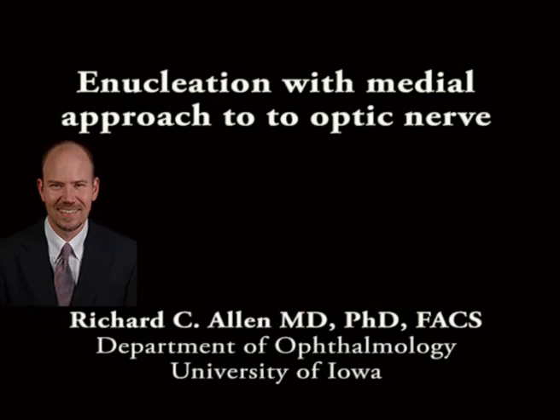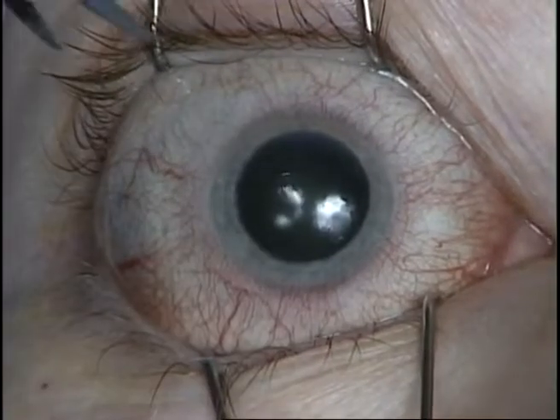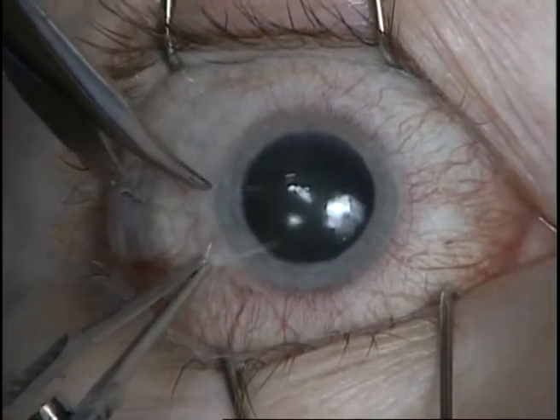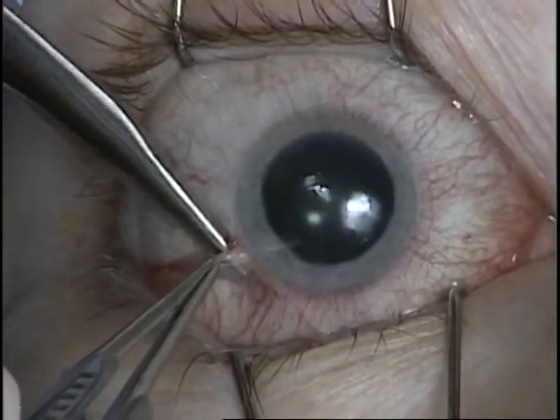This is Richard Allen at the University of Iowa. This video demonstrates an enucleation with placement of a porous polyethylene implant with approach to the optic nerve from the medial direction. The patient had a choroidal melanoma.